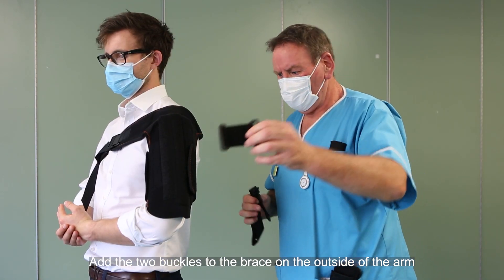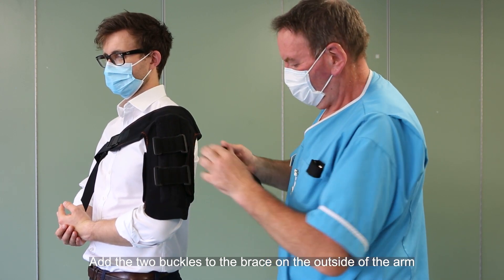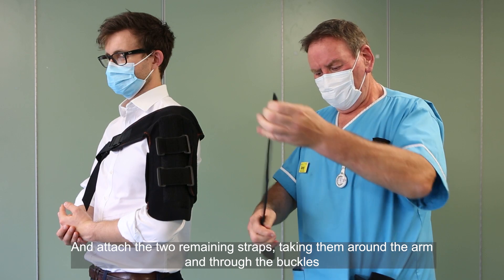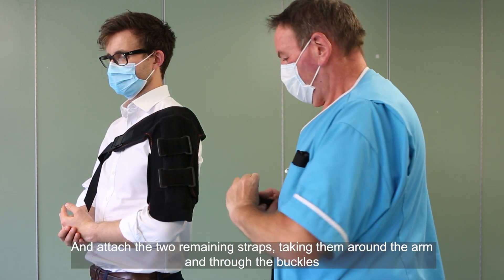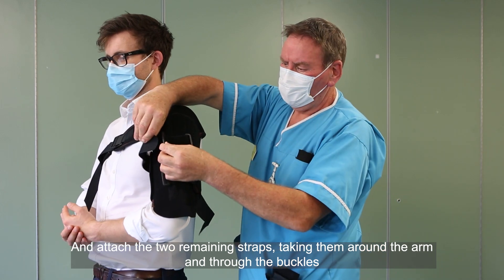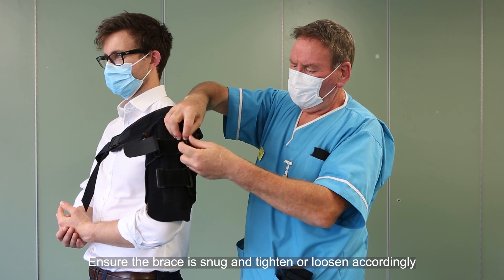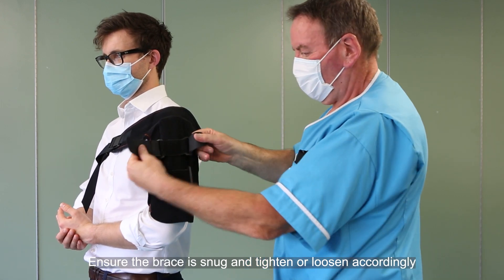Wrap the brace around the arm and fasten the velcro straps. Add the two buckles to the brace on the outside of the arm and attach the two remaining straps, taking them around the arm and through the buckles. Ensure the brace is snug and tighten or loosen accordingly.